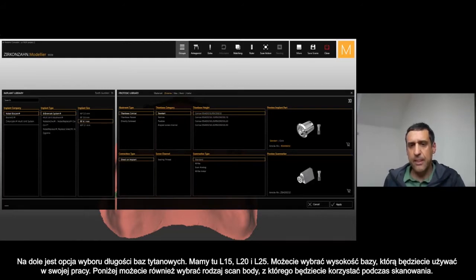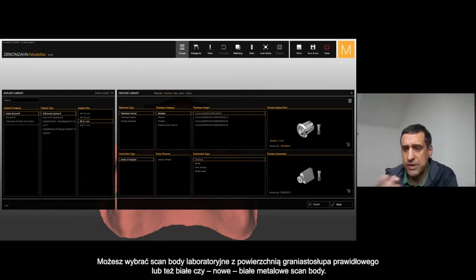On the lower part you can choose the type of scan body that you were using during the scanning. If you used the lab scan body — the triangular one — or you have the choice to select the white one or the white metal, the new one.